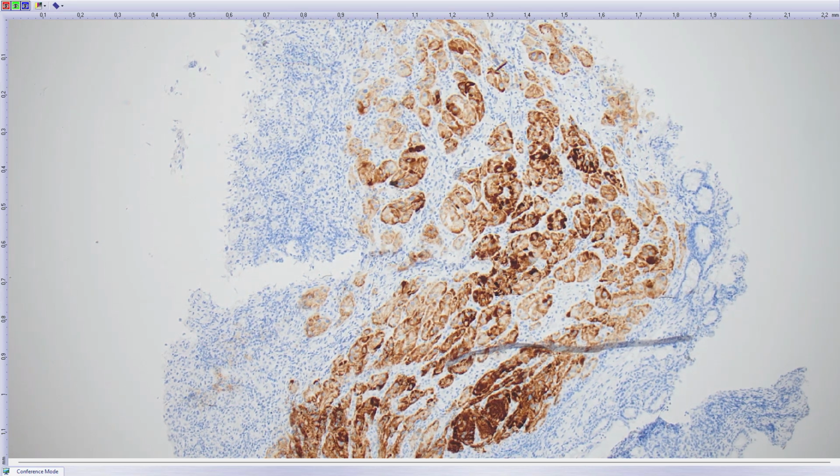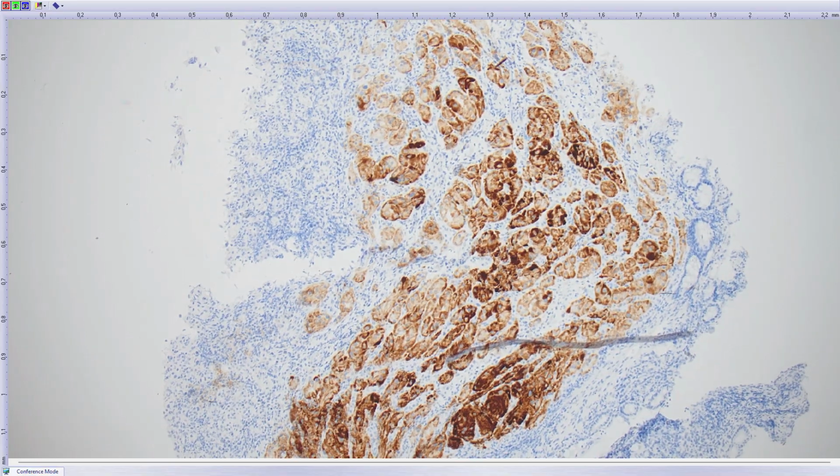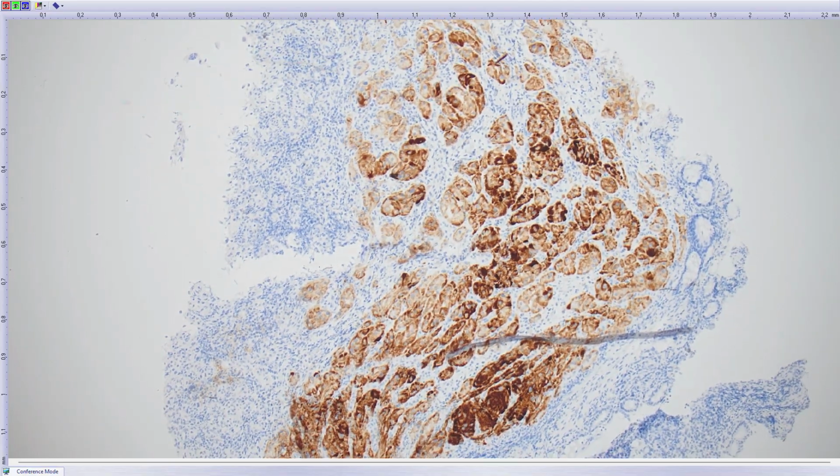So this is a metastasis from adrenal cortical carcinoma. To small intestine, yes. With no history in the patient. Okay, so this was really tricky, and I was happy to have, late on Friday afternoon, the correct diagnosis finally after 4 or 5 days of really super blunt, hard thinking.